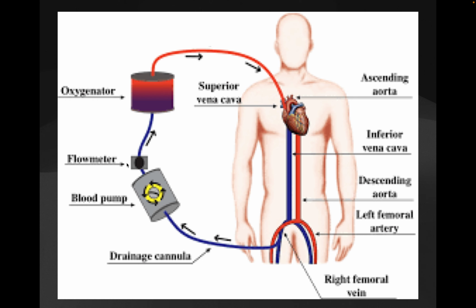And here you will be attached with a flow meter to deliver the oxygen, and of course the sweep setting, which is primarily for washing out CO2 if the patient also has respiratory acidosis along with hypoxia, and the return blood, which is red in color, will be returned through the IJV cannula inside the body. So this is essentially a very simple schematic diagram which tells us how the ECMO functions. This is the return cannula, and this is the drainage cannula.